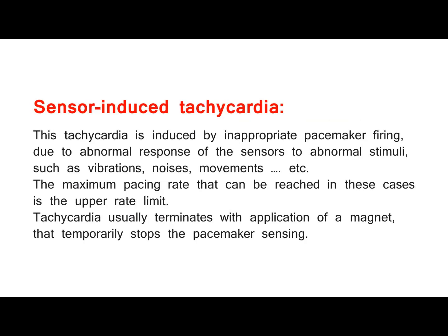Thus, prolongation of the PVARP in these patients usually terminates the PMT and prevents its recurrence. Sensor-induced tachycardia. This tachycardia is induced by inappropriate pacemaker firing, due to abnormal response of the sensors to abnormal stimuli such as vibrations, noises, movements, etc. The maximum pacing rate that can be reached in these cases is the upper rate limit. Tachycardia usually terminates with application of a magnet, which temporarily stops the pacemaker sensing.